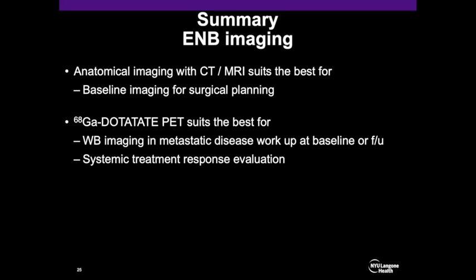In summary, esthesioneuroblastoma at baseline imaging for surgical planning is best imaged with CT or MRI. The success of surgical planning heavily depends on the success of anatomical information coming from the pre-surgical imaging, and MRI and CT, they function equally well for that purpose.